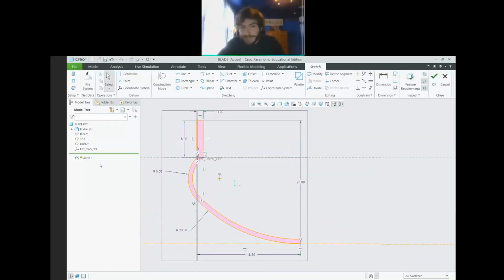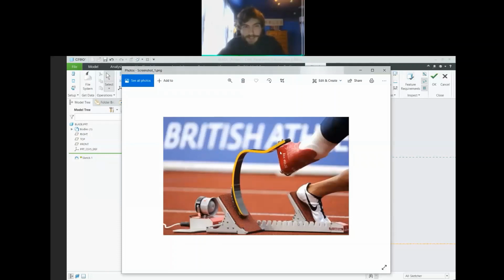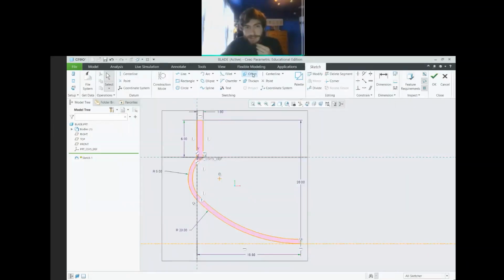But there, right, so this kind of looks like our side profile, right, from this one image. It's not too bad. So just again, we use the offset tool. We click the arc we had. We typed in -1 just because that's our thickness up here.